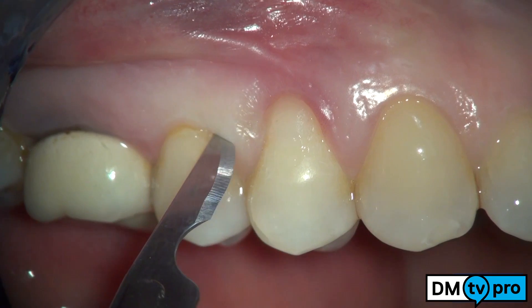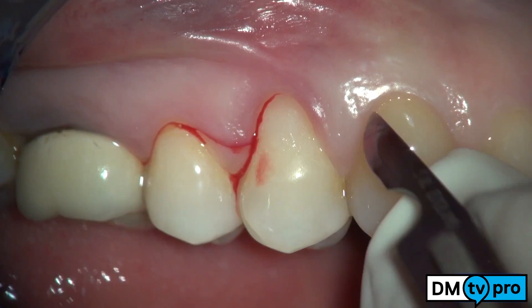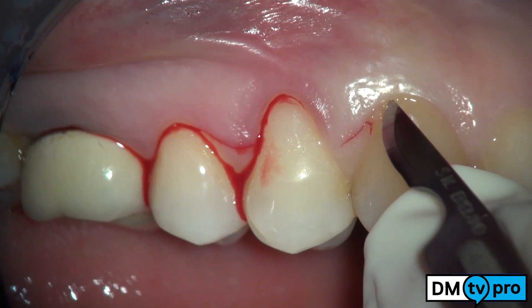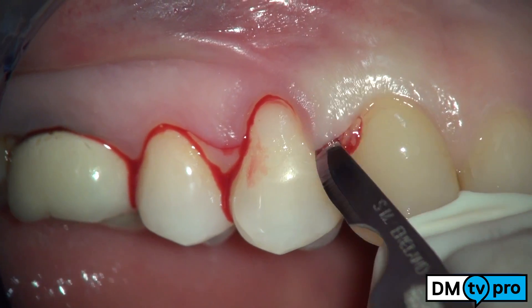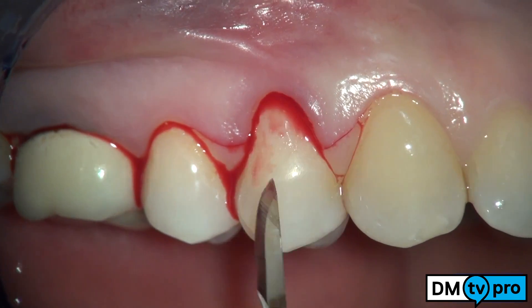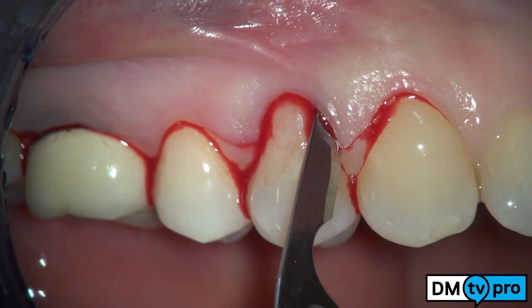The dimension of the recession is recorded in small excess along the gingival margin of the tooth to be treated. This reference point is then connected with the zenith of the gingival margin of the adjacent teeth by means of a 15C blade. An intrasulcular incision is carried out along the recession and the neighboring teeth, and the papillae undergo split thickness incision.